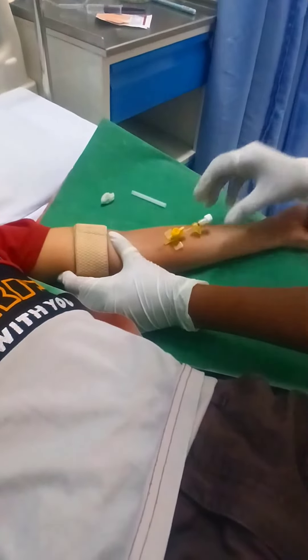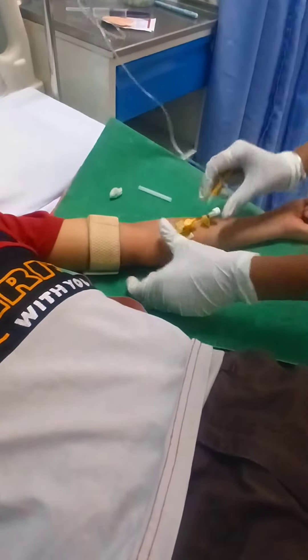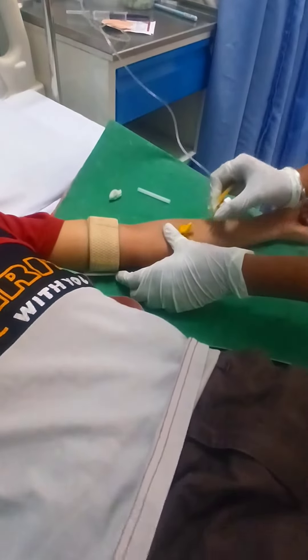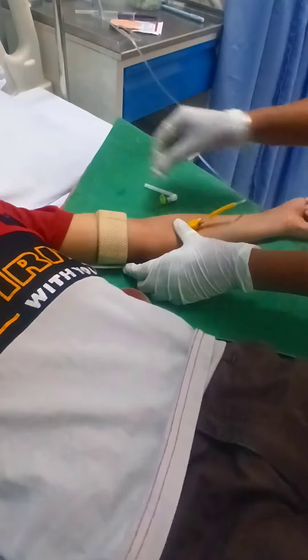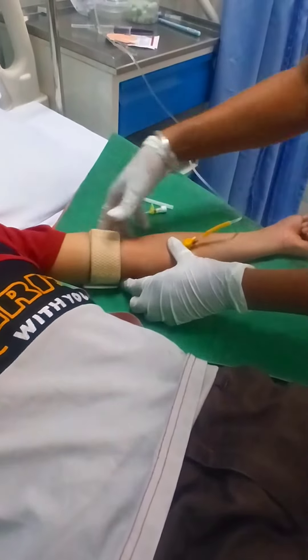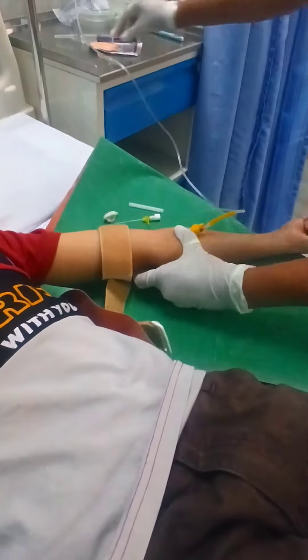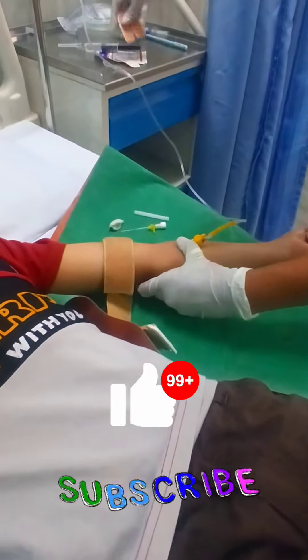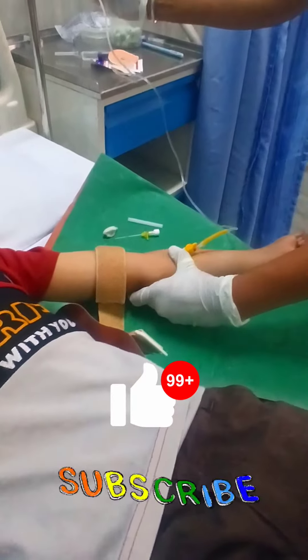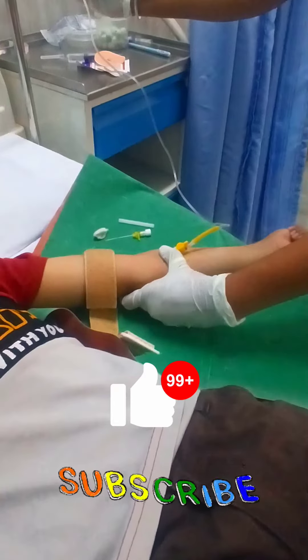What we don't have to do: don't slap the vein. Another technique is to tap the vein — you can use your thumb and two fingers to flick the vein. This releases histamine beneath the skin and causes vein dilation. And lastly, if none of these are possible, you can use technology such as vein locators, which will also help to locate the vein very easily.